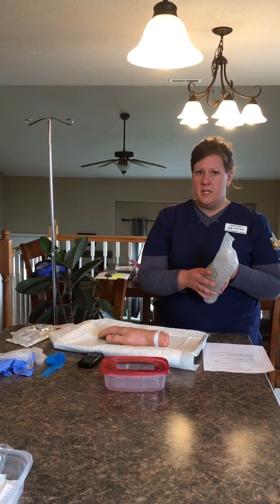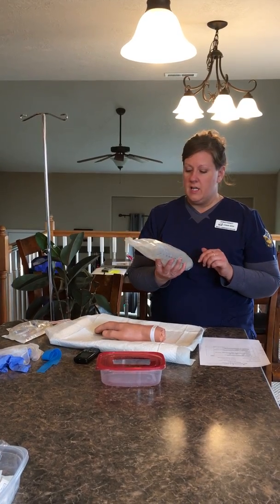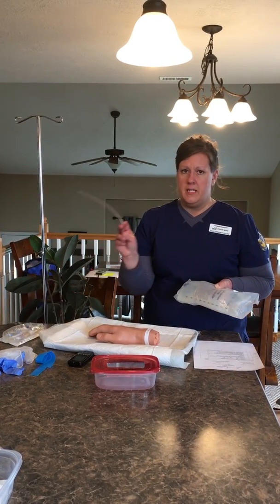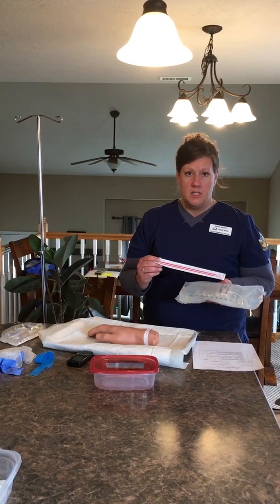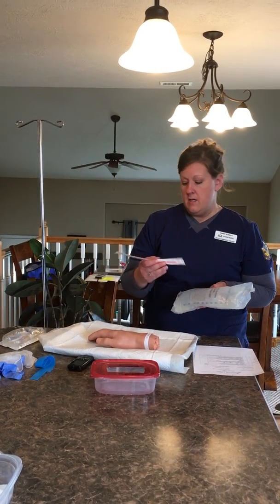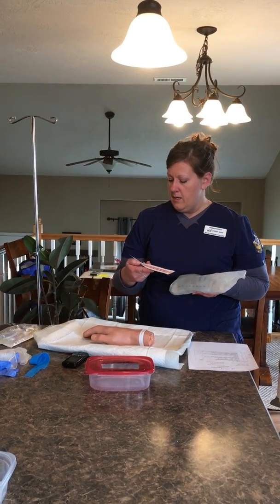When I pick my solution, I'm going to double check, looking for any particles or discoloration, the expiration date, as well as the lot number. And I will write on the tab that I'm going to put on the solution bag the patient's name, the type of solution, the room number, the date. I will initial it, also the bottle number or the lot number.